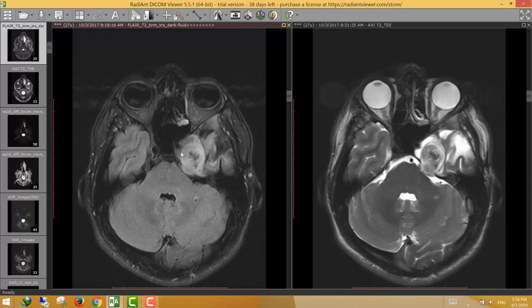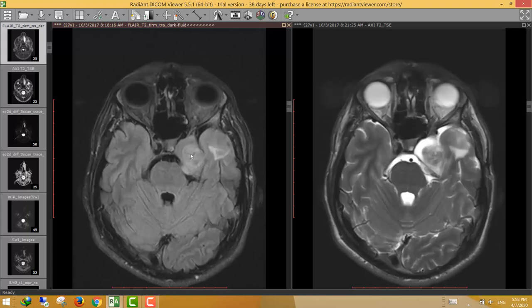We know that the carotid artery is one of the contents of the cavernous sinus, so it could be a lesion related to the carotid artery — for example, an aneurysm. We know there are multiple nerves within the cavernous sinus, so it could be one of the neurogenic tumors — nerve sheath tumors. Also, the dural covering of the cavernous sinus could be the origin of such lesions — it could be a meningioma, for instance. So there is a wide differential diagnosis for such location and such lesions.